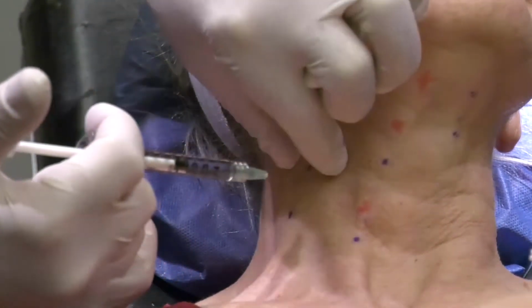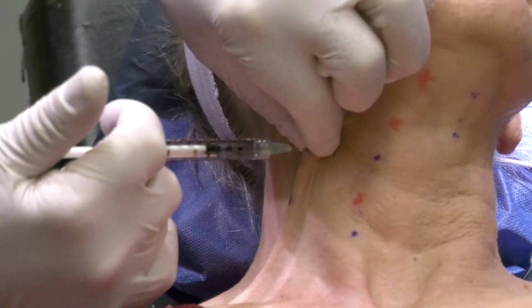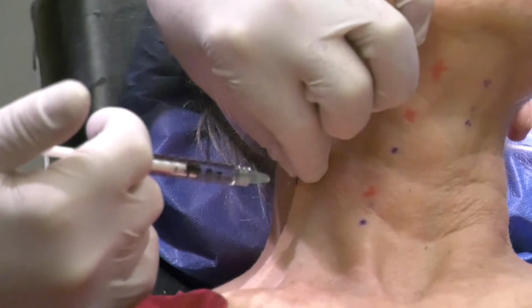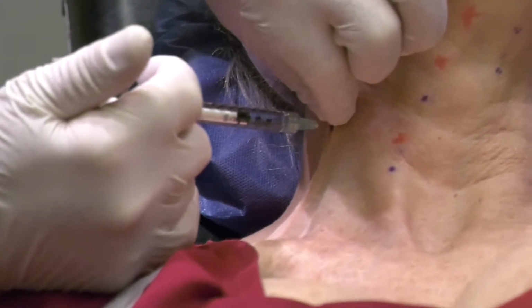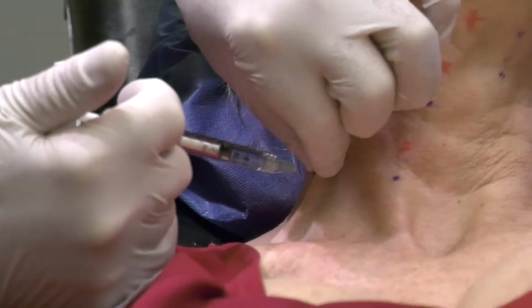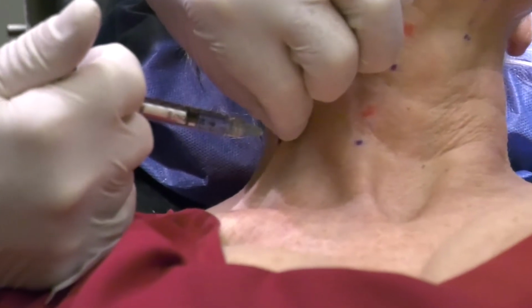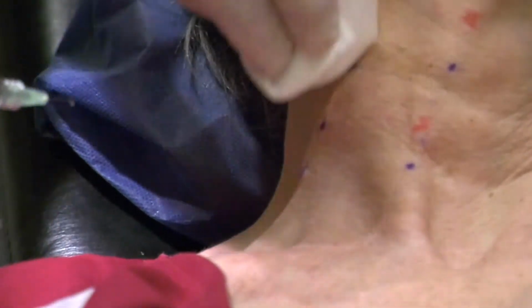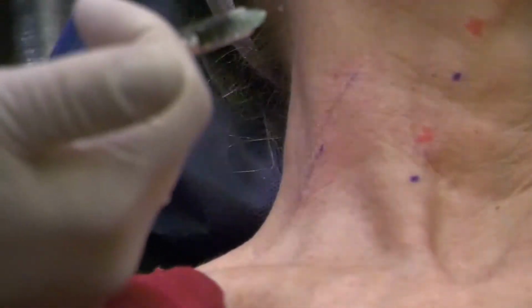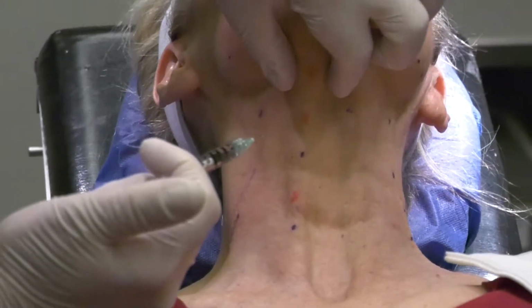What I do as far as the injection, I pick up the edge of the muscle, and the reason why I do that is, you know, that the muscles that are associated with swallowing are very closely associated. Just a little bit towards me, please. So you do have to pick up the platysma muscle.